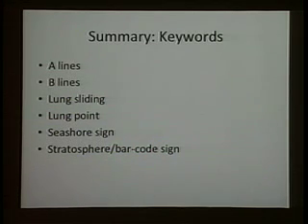And then I grab my probe and do a surface echo in 10 seconds. I go subcostal, apical, parasternal, boom, boom, boom, just to confirm the diagnosis sometimes, for my own sake, and for the sake of the resident working with me that day, so they can do surface echo. So every case they do, besides getting TE, they get a surface echo. It takes 2 minutes. The machine is there, the probes are there. So you should take advantage of that. You should do that as a routine thing.